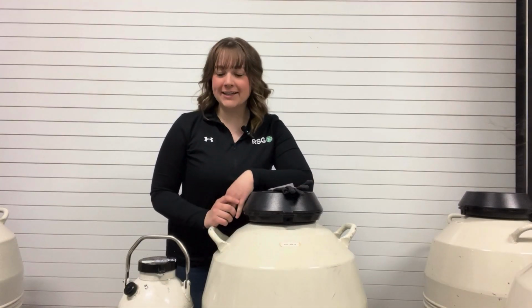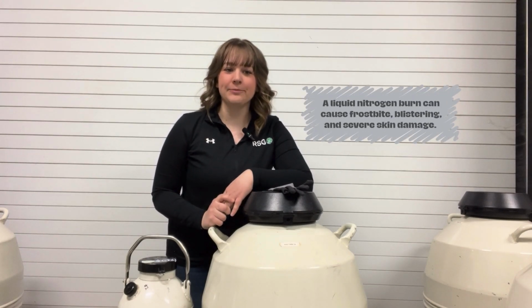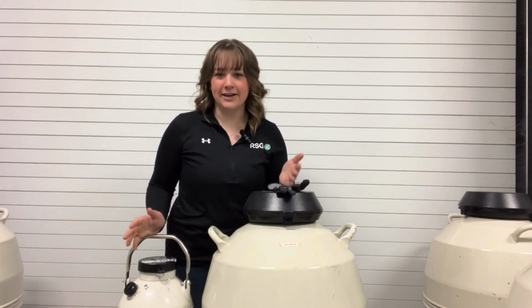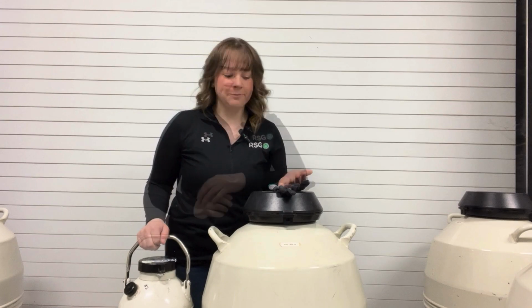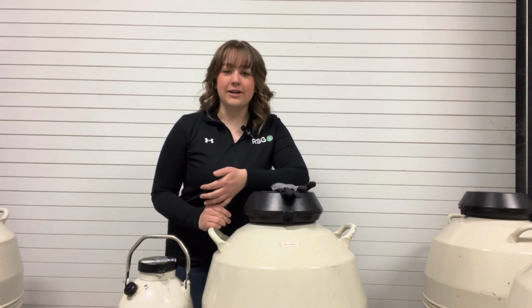First and foremost, when handling anything frozen in liquid nitrogen, we recommend wearing gloves to reduce the risk of a nitrogen burn. On my left-hand side here is a regular storage tank, and then on the right is a vapor shipper tank that we use to send genetics all across the country. Let's say that you have a client who wants to purchase 2 units of semen from one of your sires. To safely get the client those units, you're going to need to split them out in liquid nitrogen.